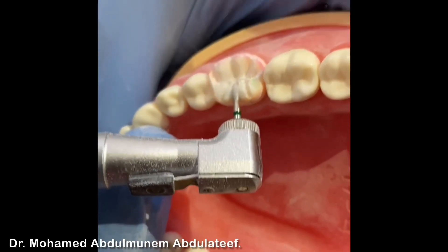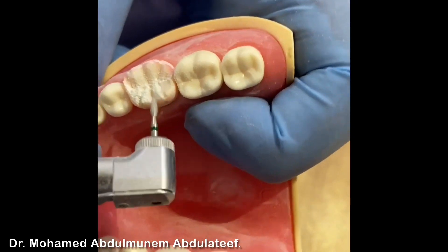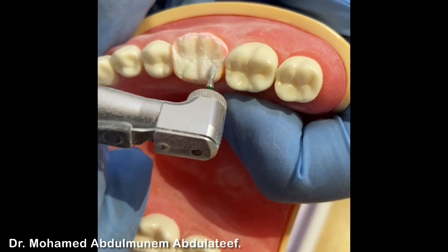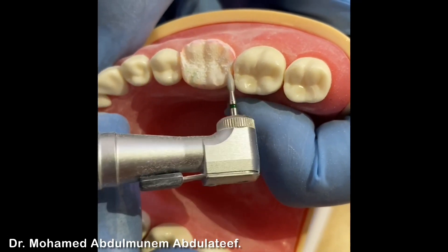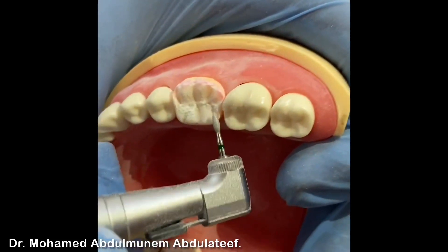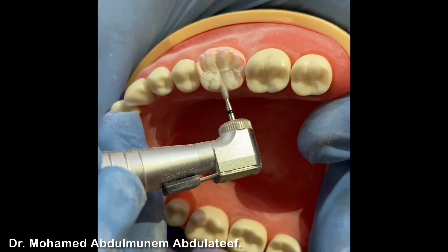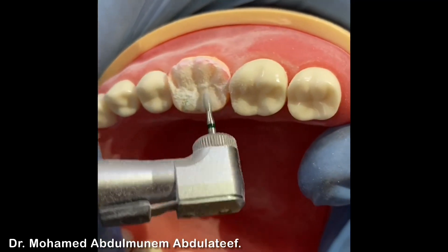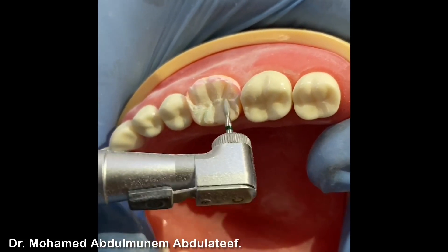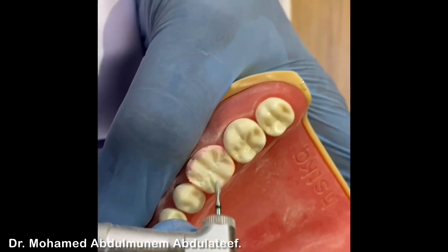Now we go on with the process. We have the distolingual cusp reduced. As I said, all the reductions at this stage are initial ones — at the end you can do reshaping and refinement. Now we move to the mesiolingual cusp, same process as we did with the distolingual ones, following the inclination, then do the reduction.